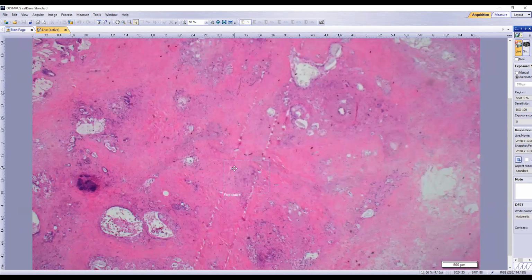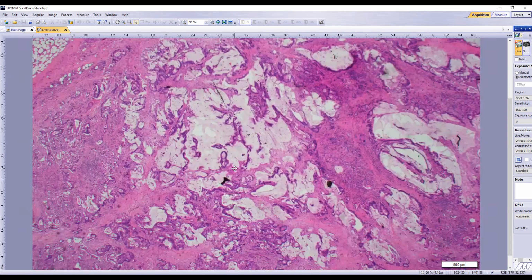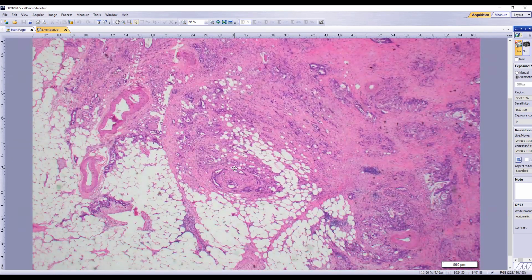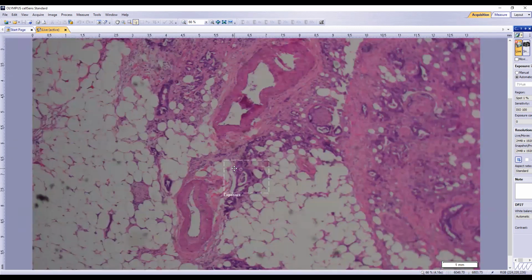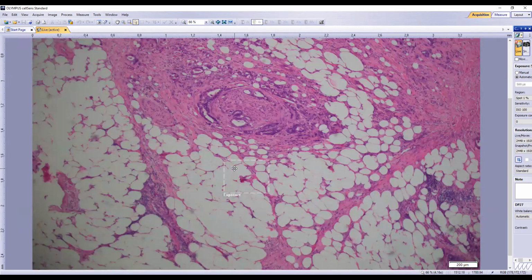Now this one, okay, this is just a garden variety pancreatic ductal adenocarcinoma. I think I had this slide mainly to highlight a couple of features.